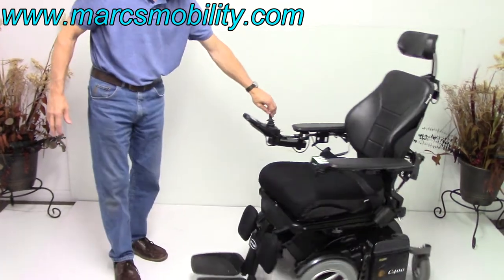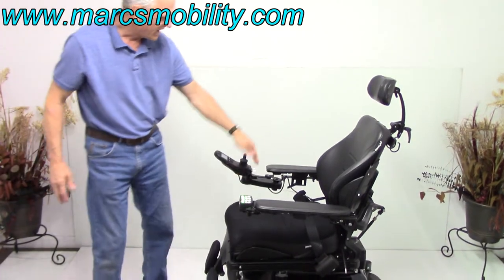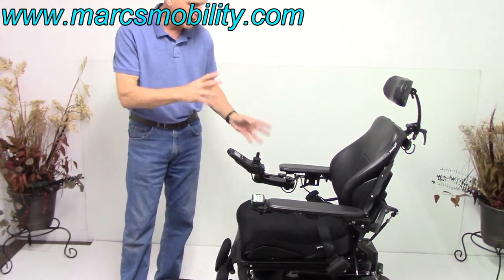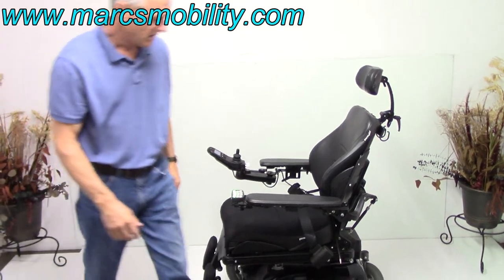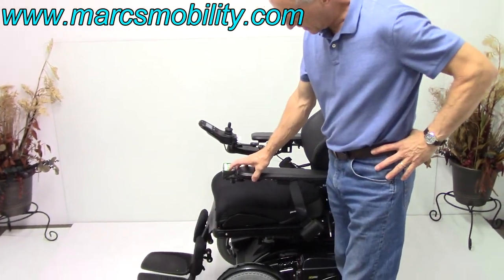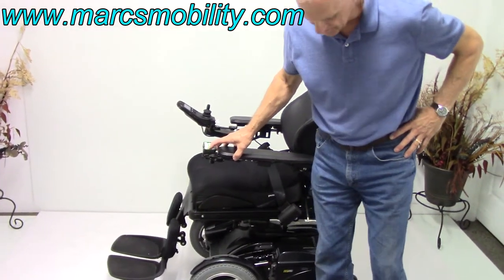I'm going to turn the chair around. The switch box can also be put behind the joystick — some people like it here, some people like it behind the joystick. If you're right-handed or left-handed, we can switch the joystick from one side to the other, no problem at all. So the first thing we're going to do is the electric seat lift — this would be your 8-inch electric seat lift.